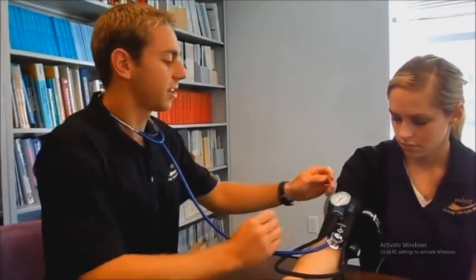But essentially what you're looking for is when you release the air, you'll see the dial go, and you'll begin to hear thumps, usually around 120. That's just kind of an average. Some people might be a little higher, and a lot of people are lower than that.